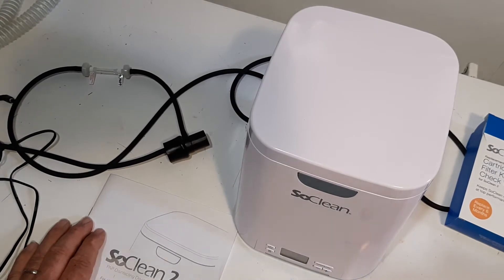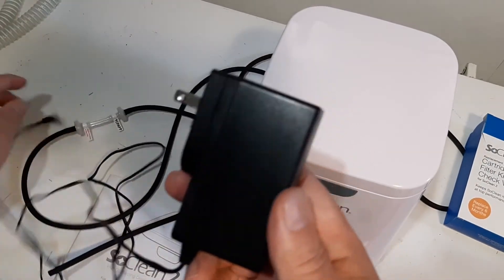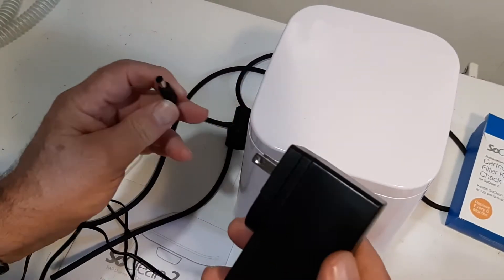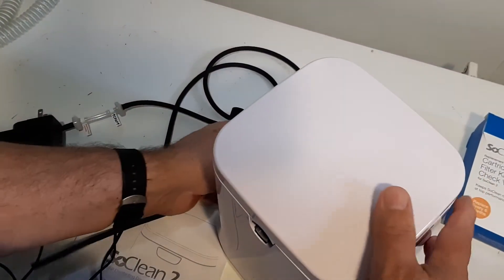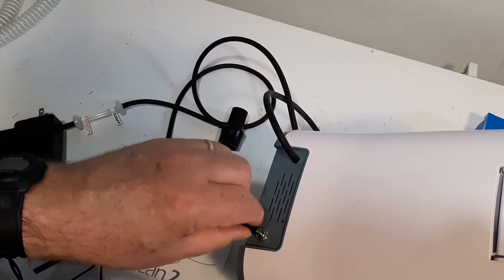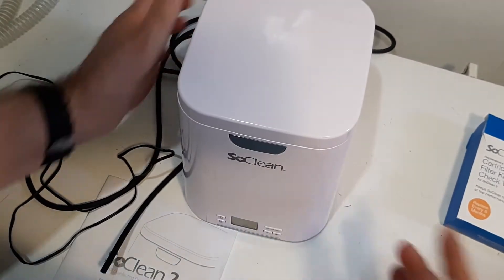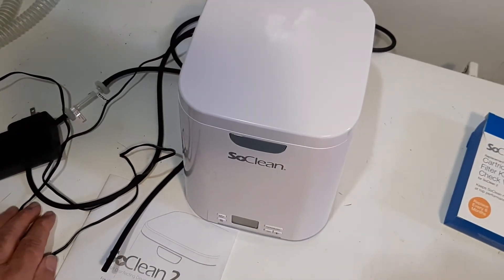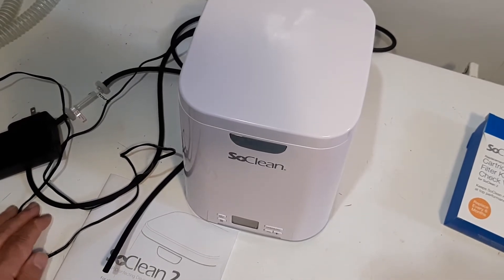So we're going to look at setting the time on this thing. In the back of the unit we're plugged in — this is the plug that comes with it, like a DIN connector in the back. The hose is already connected to the back of my unit. So we're just going to plug it in, turn the power on, set the clock up, and I'll show you some other things about it.